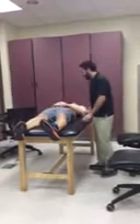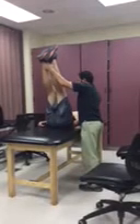Next thing I'm going to do is have his knees extended. His hips are going to be in 90 degrees of flexion. I'm going to hold it up at 90 degrees. I'm going to put my hand under his back. And this test is going to be the lower abdominals. So I'm going to cue the patient to slowly go into hip extension, while keeping his lower back touching my fingers. Okay, right around here, I'm going to hold this, and once the lumbar has left my fingers, that's where I take the angle. Axis of rotation is going to be at the greater trochanter.